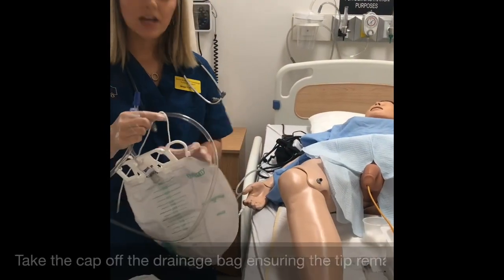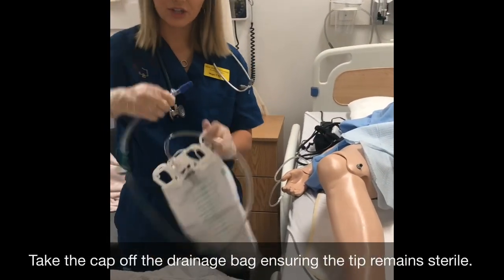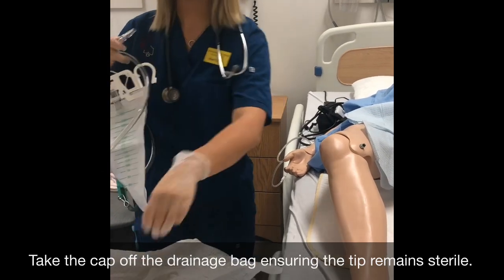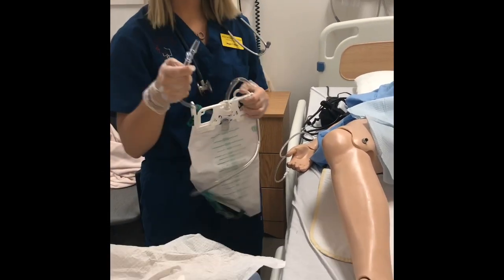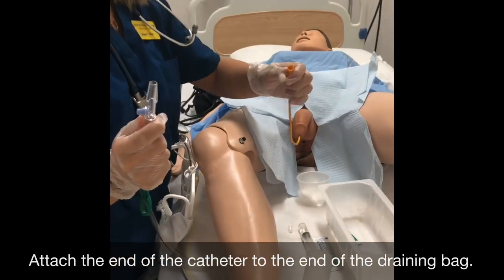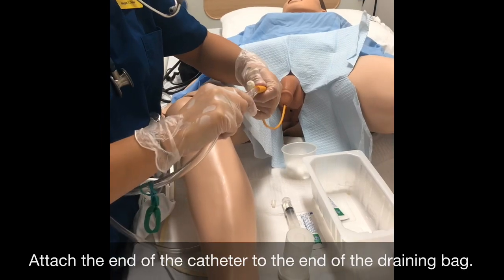So now I have my drainage bag, and I'm going to take off the blue cap, making sure I don't touch the tip of the drainage bag because that is still considered sterile. I'm going to attach this end onto the end of the catheter.